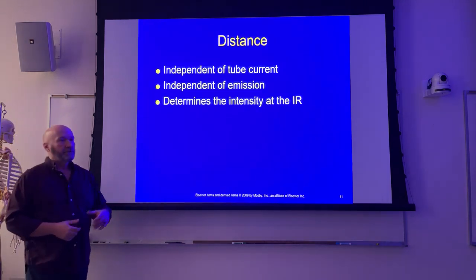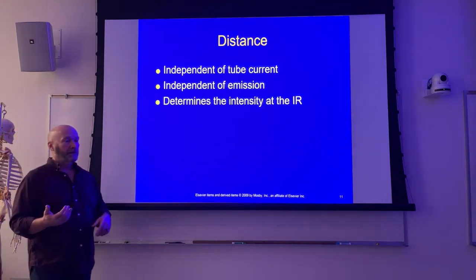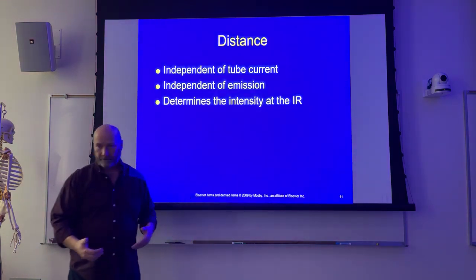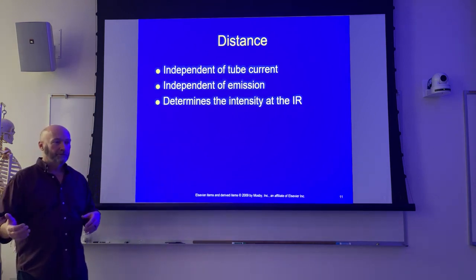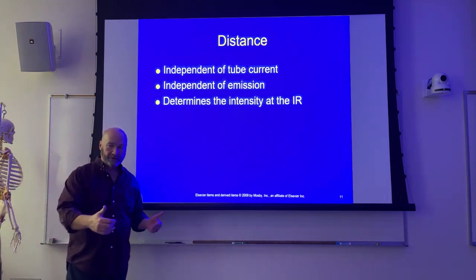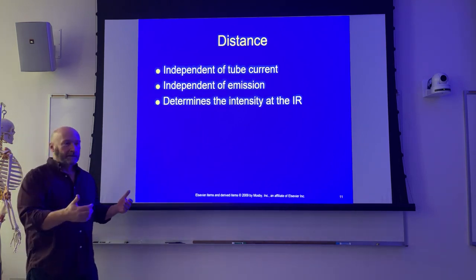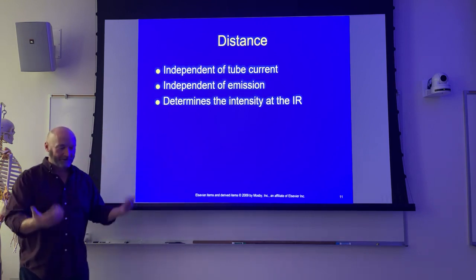Right, so it's independent of tube current, and what I mean by that is that whenever you're reading the questions on the test, read the question and consider what the question is asking you. Right, so if I ask you a question that says you shoot an X-ray at 40 inches, now let's remove all variables and say you're doing a portable chest X-ray. You shoot a chest X-ray at 40 inches today, or yesterday, let's say, and you made a good exposure. The patient couldn't sit down, or couldn't sit up, rather.